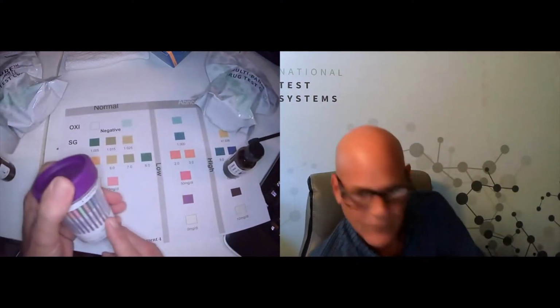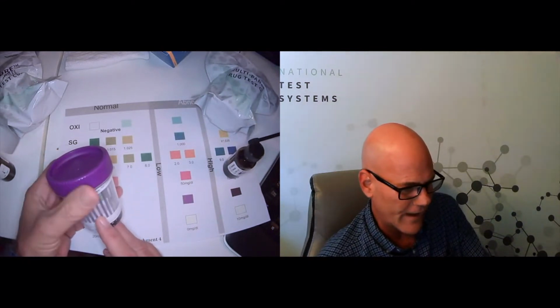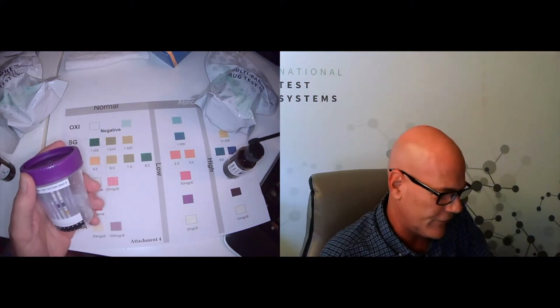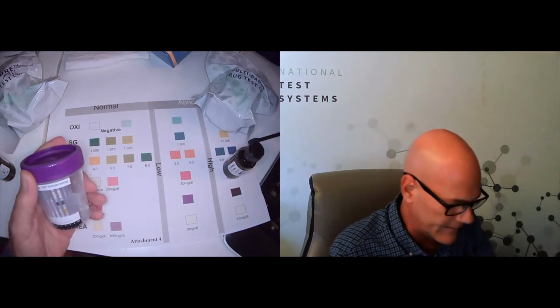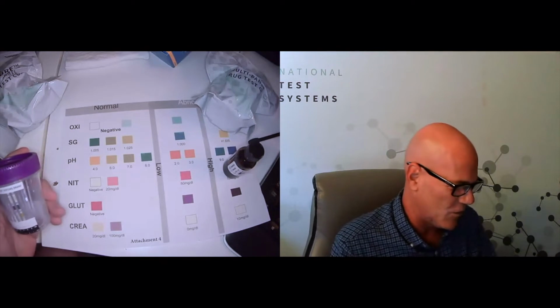And we can see just from the other strips that the liquid's already migrating up these strips. So we got our wicking. We're probably fine. Again, at home, please do wait the full one, at least the 1 minute. And I know I say at home, but you know what I mean. Please do wait at least the whole minute.